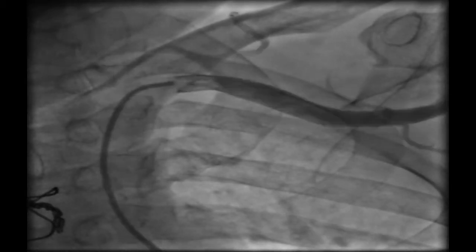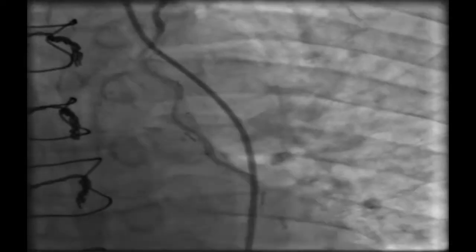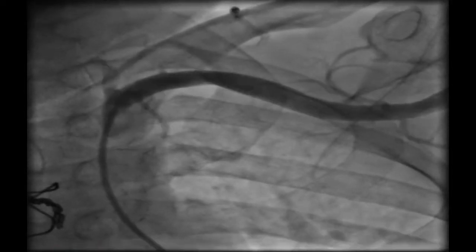This is a stump of another saphenous graft that showed total occlusion after the stump. Regarding the LIMA, selective cannulation was somewhat difficult due to angulation, but it showed a distal LAD lesion after the anastomosis — a critical lesion. And here we can see another lesion at the anastomotic site.